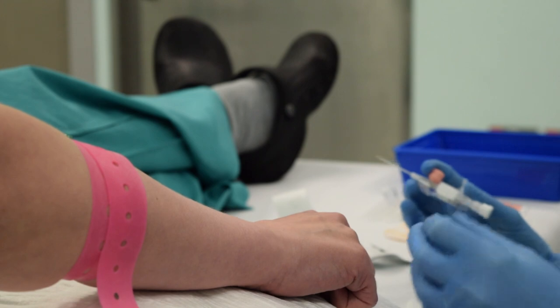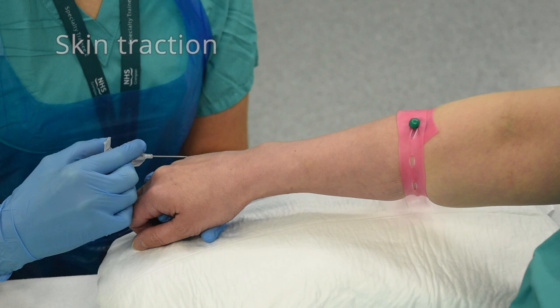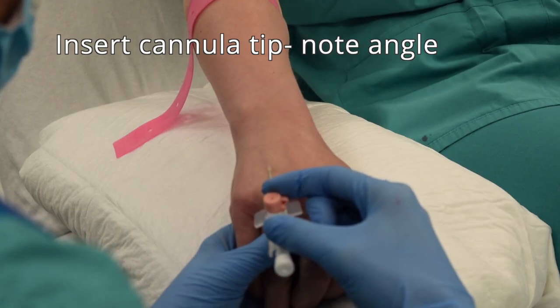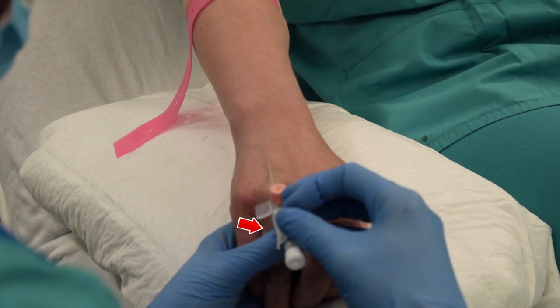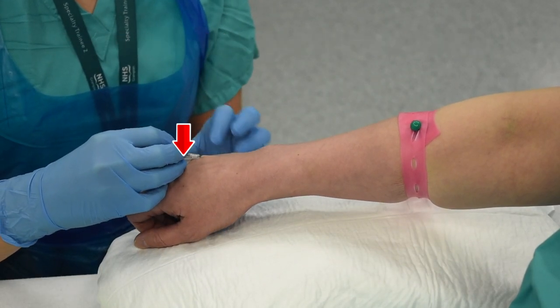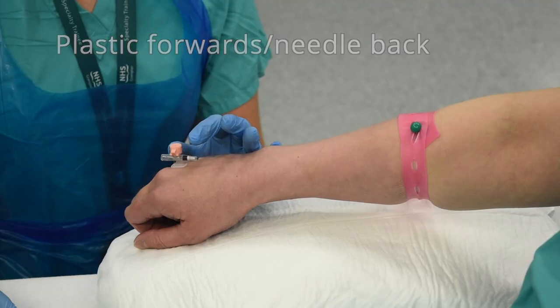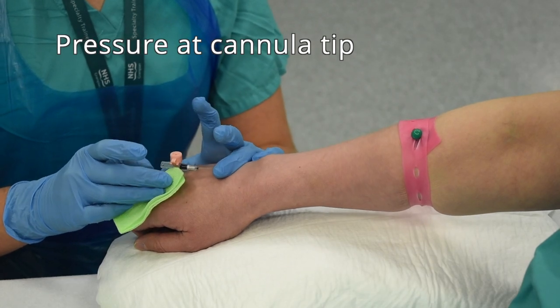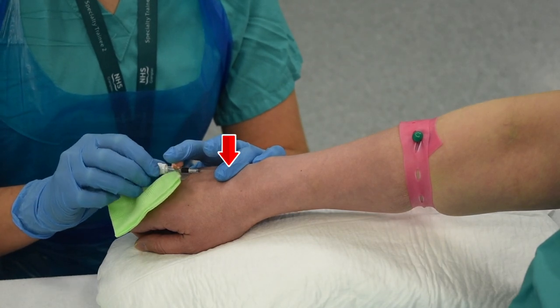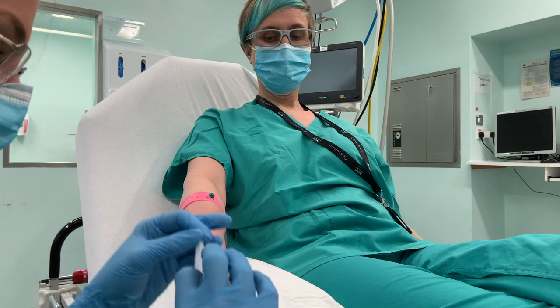It's important to make sure the skin is held tight and that you don't let go at any point — if you do, you will lose the positioning of your needle tip. Advance the cannula into the vein until you get flashback, then retract the needle and see the second flashback through the plastic cannula sheath. Advance the cannula, remove the needle, and discard the sharp safely, putting firm pressure on the vein proximal to the tip to minimise bleeding while you secure the hub, bionector, or octopus at the end.